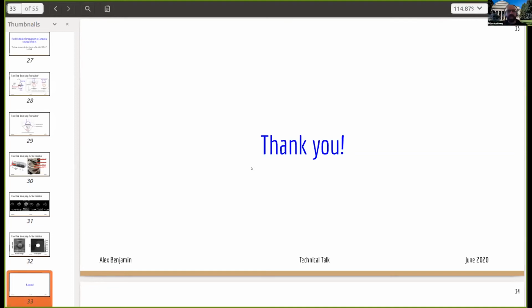Great, thank you, Alex. Another question from Vipender: could you adapt the method to look at internal vasculature like the aorta? It would be useful for looking at atherosclerosis and plaques. That's a great question. There are two ways you can look at that. One is you can use the existing localization framework and say, rather than reconstructing kidney volumes, I'm going to reconstruct plaque volumes. It would rely on having good segmentation of the plaque within the blood vessel itself. But yes, you could effectively get estimates of plaque volume as a function of the vessel itself.